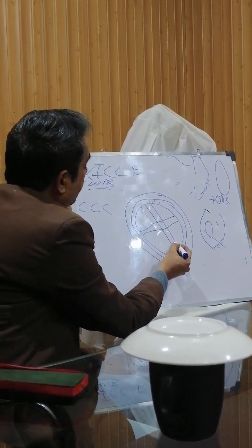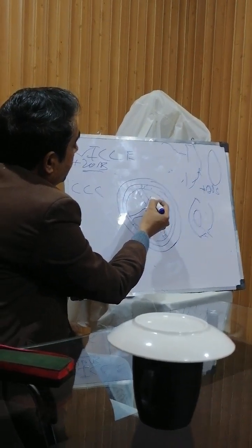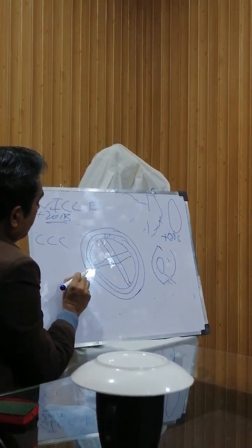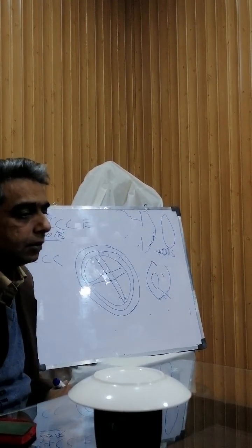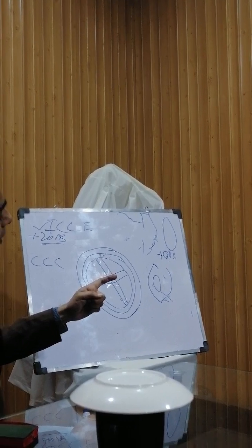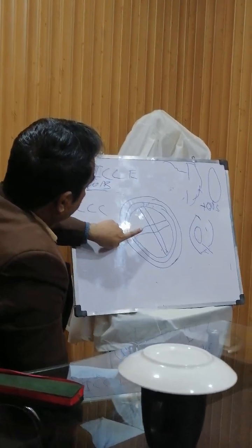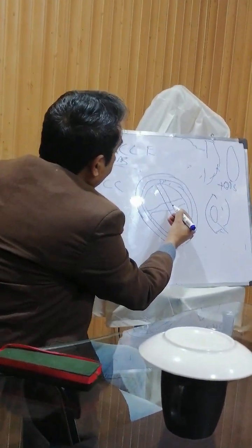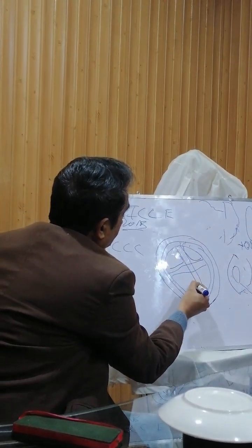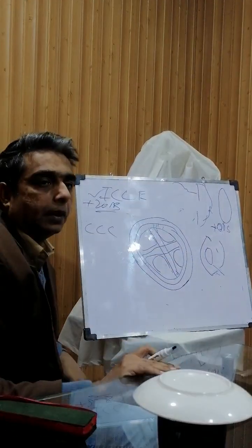So now we have made two grooves, and we have divided the nucleus into four parts. Now we will make an opening here, and a small incision, and a small instrument like a handle or chopper, which is like a finger and is turned like this, we pass it in from here, and with the probe here we break these four parts separately into freely floating four parts. Now these are free floating four parts in the eye.